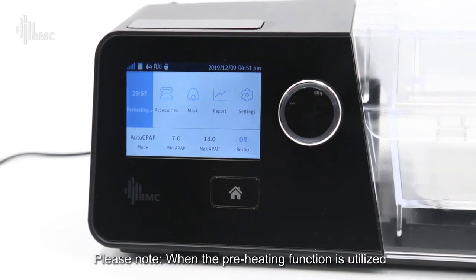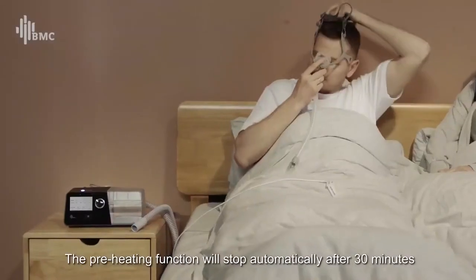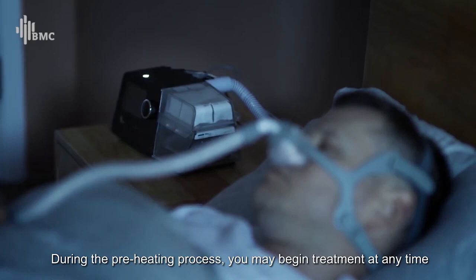Please note, when the preheating function is utilized, the device will output a very low airflow to prevent water vapors from entering the device and damaging it. The preheating function will stop automatically after 30 minutes. During the preheating process, you may begin your treatment at any time.